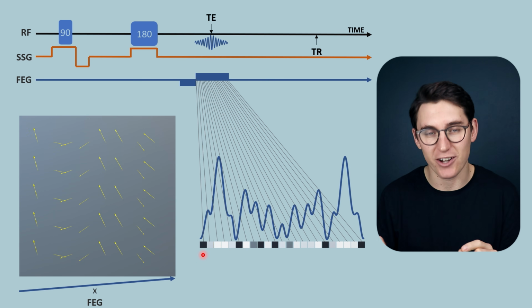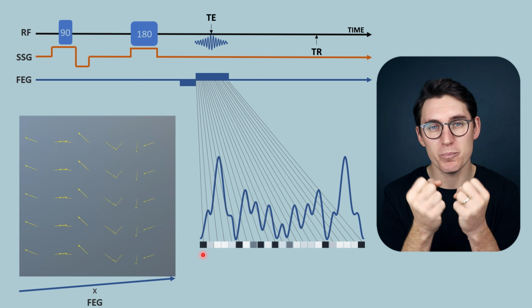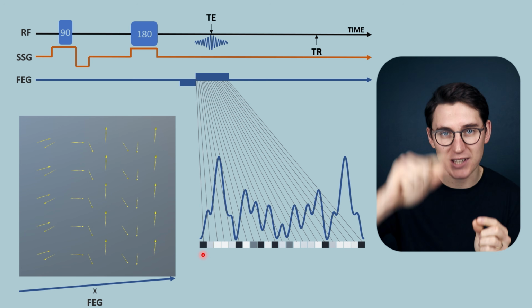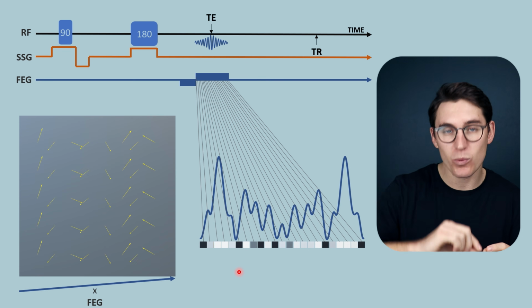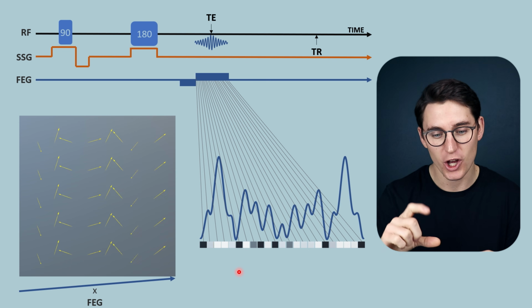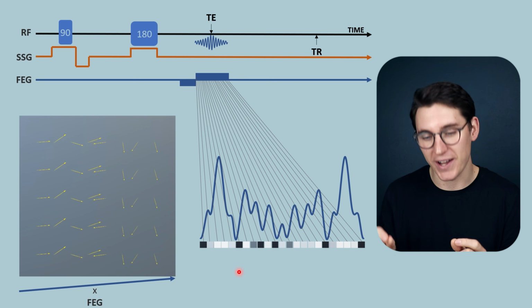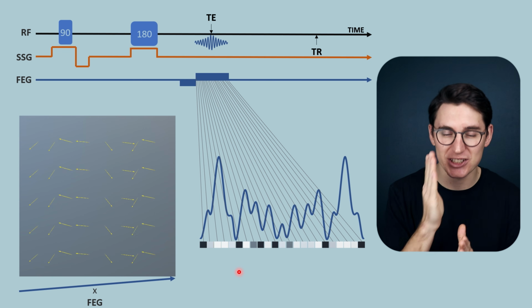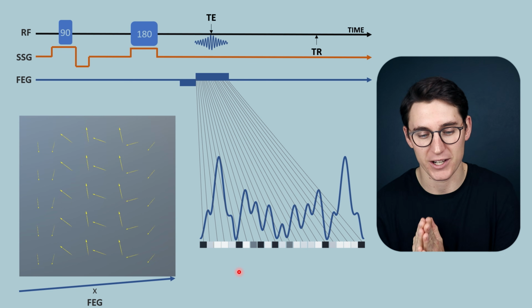Now these grayscales are not representing the pixels within our image. They're representing a numerical value, an actual data value of this wave that we are measuring here. As the wave increases in amplitude, we're getting a higher numerical data value.